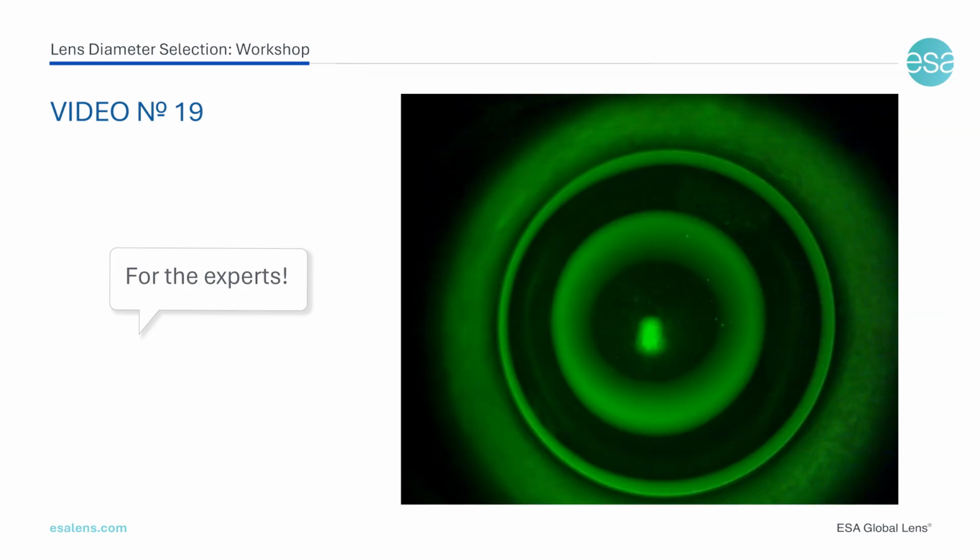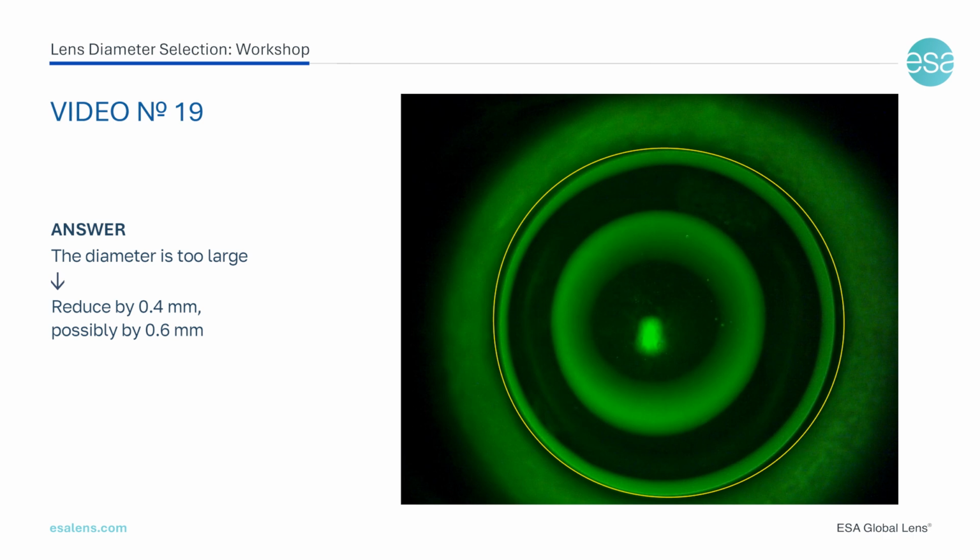What do you think of the diameter of this lens? What is your proposed action? It was, of course, a joke that this video is too difficult to analyze. The lens is practically immobile, making this quite a straightforward case.